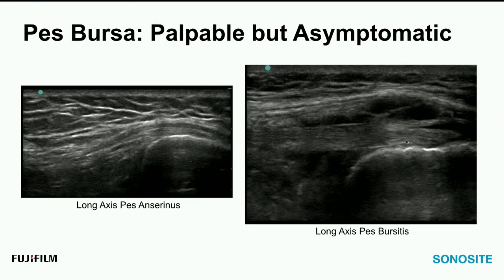And you can see all these little septations. If you were to try to aspirate this, your needle would get trapped in one of these septations. So you might want to attack all of these with a needle and drain them individually if they weren't communicating. You can see that with ultrasound really nicely and be able to drain the entire soft tissue fluid collection if it was free fluid. Another hint that it's free fluid is all of this posterior acoustic enhancement on the femur, on the tibia.